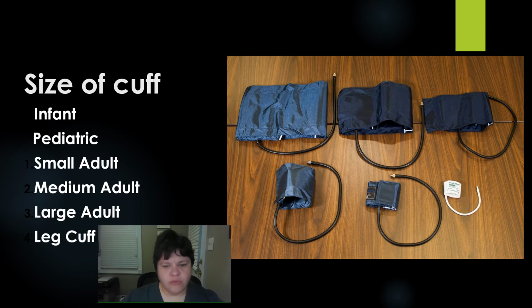One of the most important decisions when taking blood pressure is what size of cuff to use. If you use too small of a cuff, your blood pressure will be inaccurately elevated. Too large of a cuff, and it will be decreased. So how do you decide on what size of cuff to use?